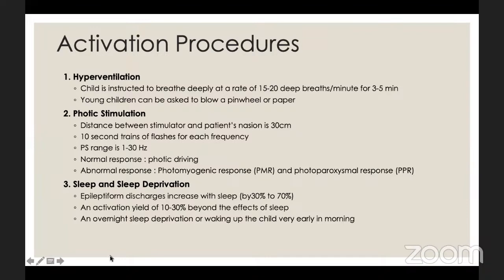They say that epileptiform discharges increase with sleep by 30 to 70%. So when you are requesting an EEG for a child, you may request an awake and sleep record. Sleep can be natural or induced by drugs. In the awake record, especially for primary generalized epilepsies like absence epilepsy, you may request hyperventilation and photic stimulation. An activation yield of 10 to 30% is achieved with sleep deprivation beyond the effects of sleep, and overnight sleep deprivation or waking up the child very early in the morning may help.